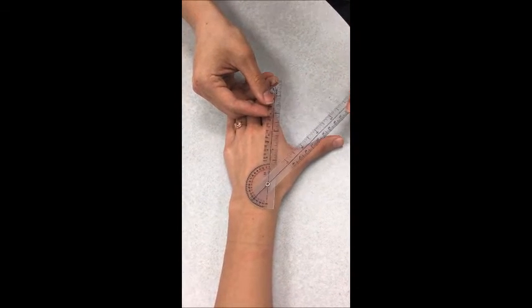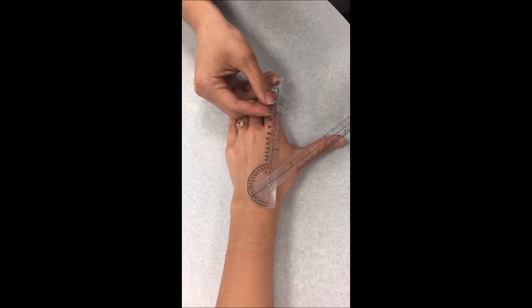Normal range of motion with the alternative method is 0 to 50 degrees.